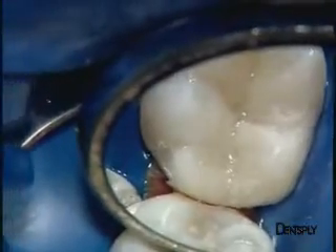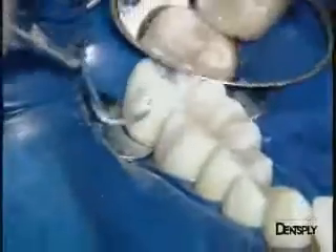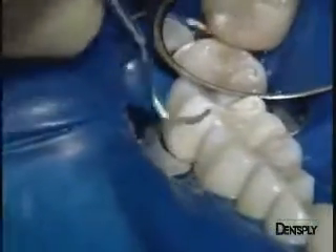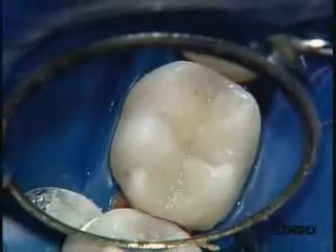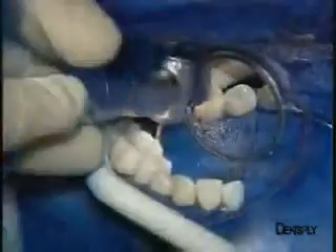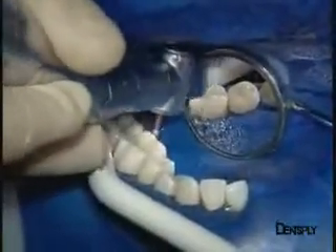A few excess amounts still need to be removed, especially at proximal level, and the curettes used in periodontal treatment can also be used to remove these amounts. We now have a clear, almost definitive outline of the occlusive anatomical configuration.